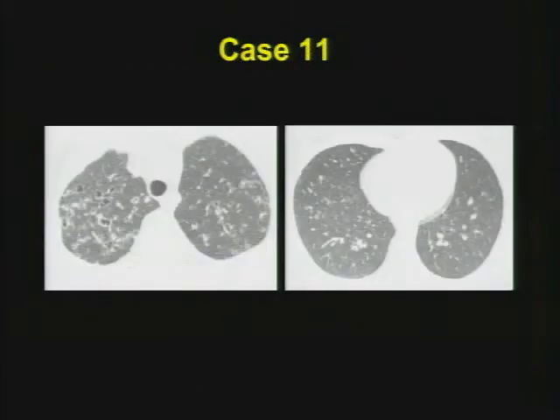Case number eleven: a pair of images from a high-resolution CT scan. Notice the anatomic distribution of the abnormality. Characterize the lesions by their margins, their shape, their size, their anatomic distribution. So multiple cystic lesions on a high-resolution CT — what is your differential?